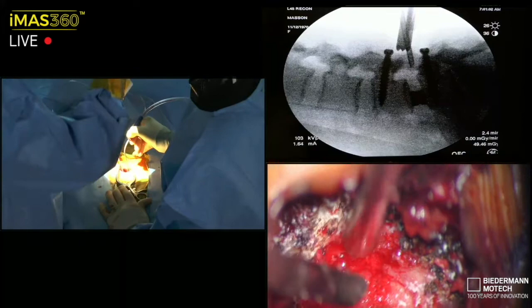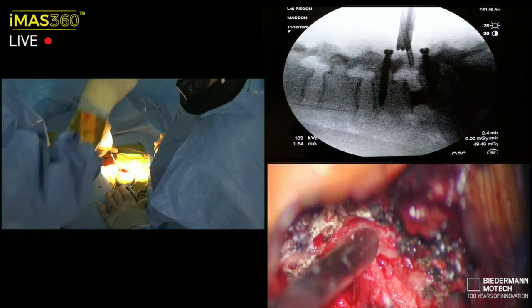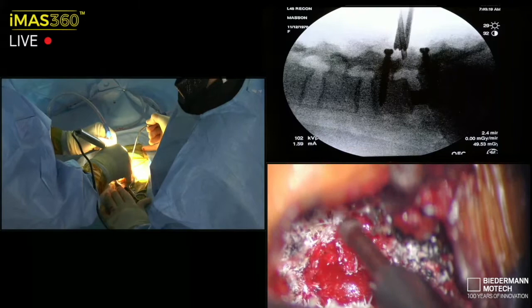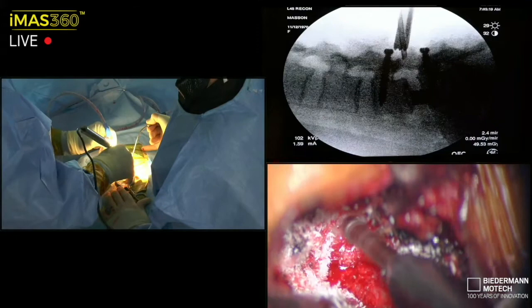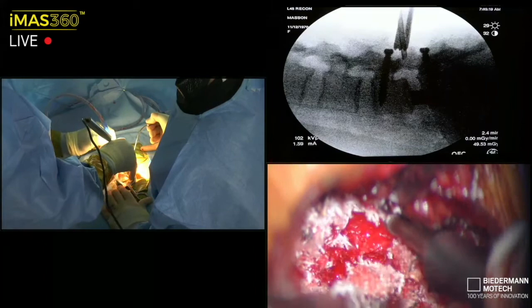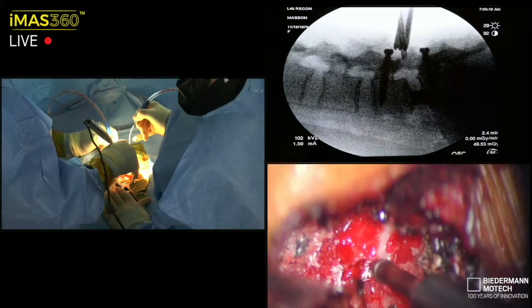No matter what, fundamentals of understanding where you are, you can see the dural margin right here, coming to that bone there. And that's where I am fluoroscopically height-wise. So we'll come to the base of the dorsal spinous process and the base of that lamina. And I'm going to use the intact lamina to find where the internal laminectomy is going to be as I approach the dura from that area. Because ultimately we're going to have a silhouette of where the dura is going, and that's going to dictate our depth in the more obscured scarred in areas.